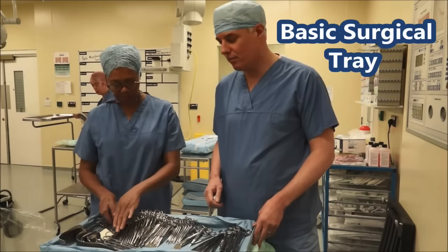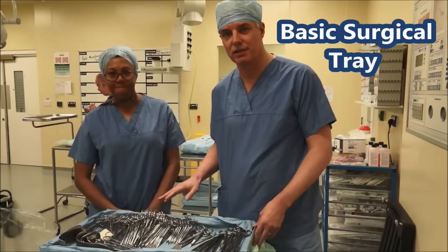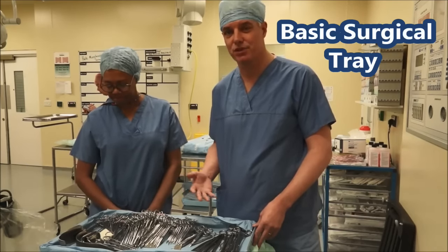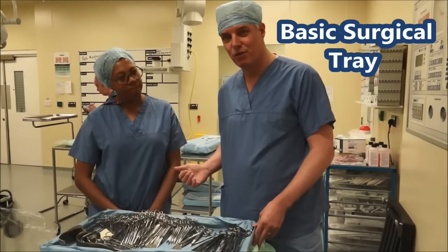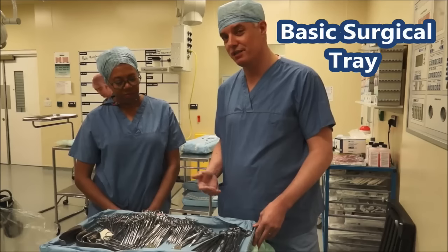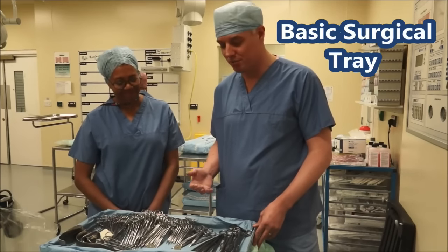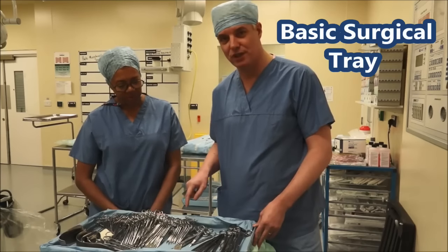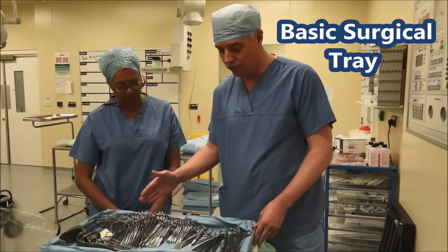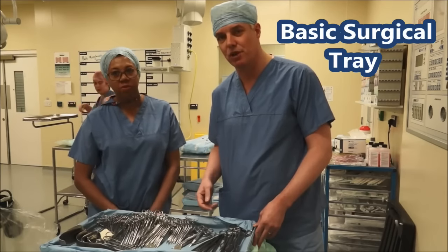Hi, so we're here in theatre. What we thought we might do today is go through the kind of instruments you might encounter when you come to theatre. You need to know the names of things. I'm here with June Brown, one of our theatre practitioners, and when I'm operating I need to tell June what I need — she often just knows anyway, it's a sign of a good scrub nurse. So we'll go through the things quickly and then I'll show you each of the instruments and talk about what they're used for.